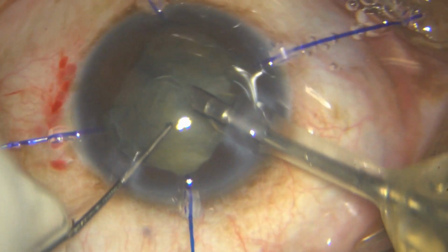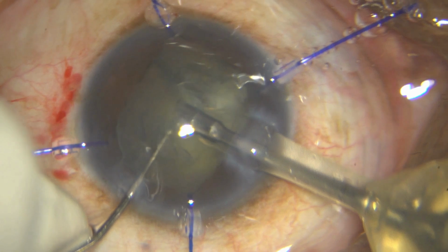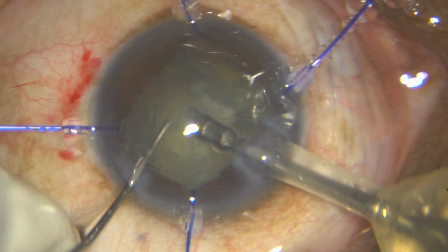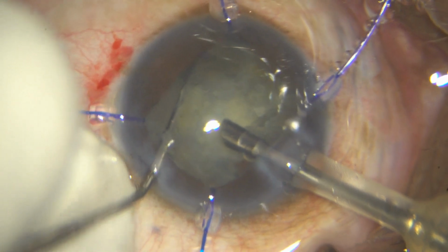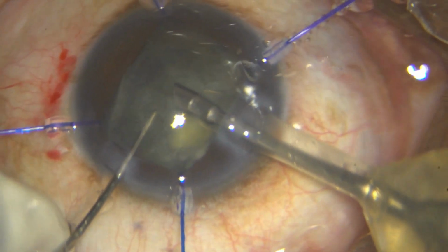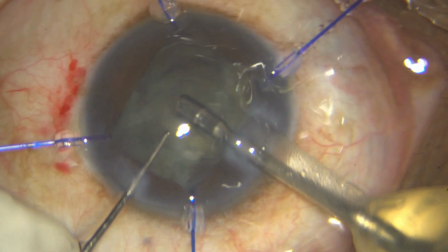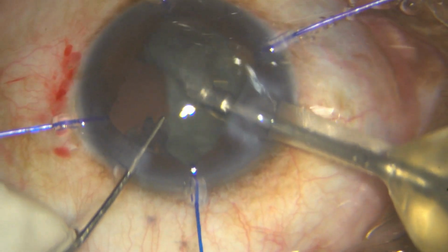The vision is not that great in the other eye as well, which will need surgery also at a later date. So I have to be very careful in this case. However, all seems to be going well. Remains to be seen once I remove the pieces. Looks like some are still there. Yeah, that's it. The segment has come through. Once you get one segment, it's very easy to get the rest of it out. And as I said, very small central core nucleus. Most of it is this epinucleus. And I have to be very careful not to bring the PC into my phaco tip.